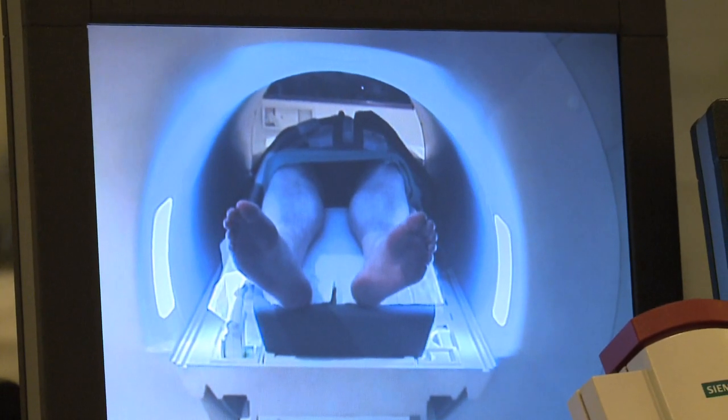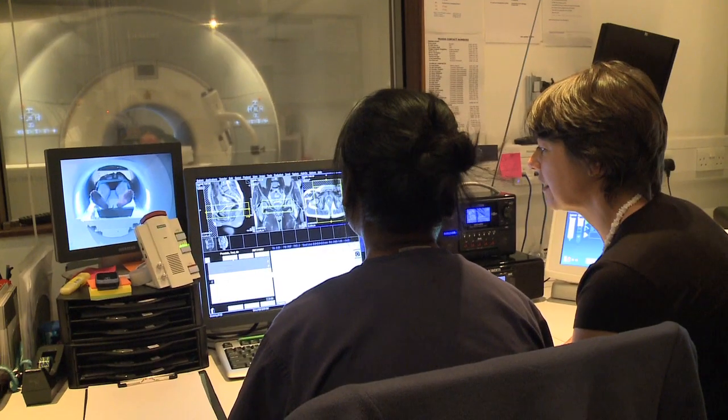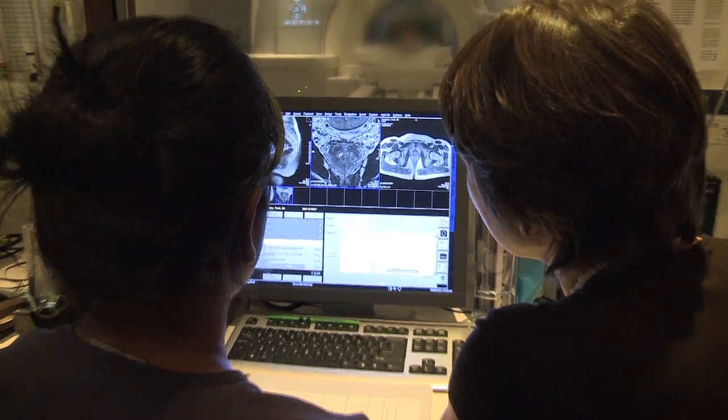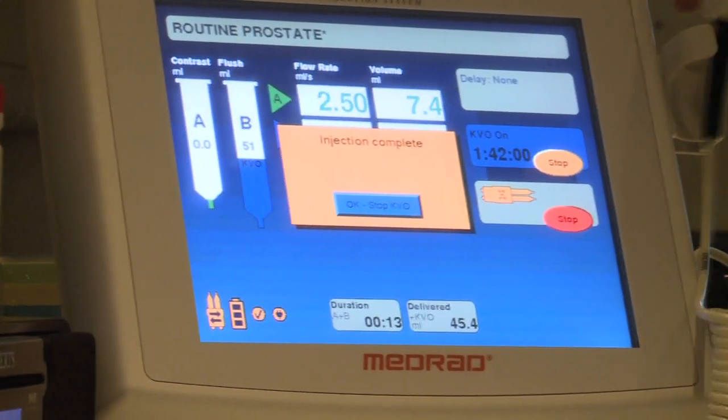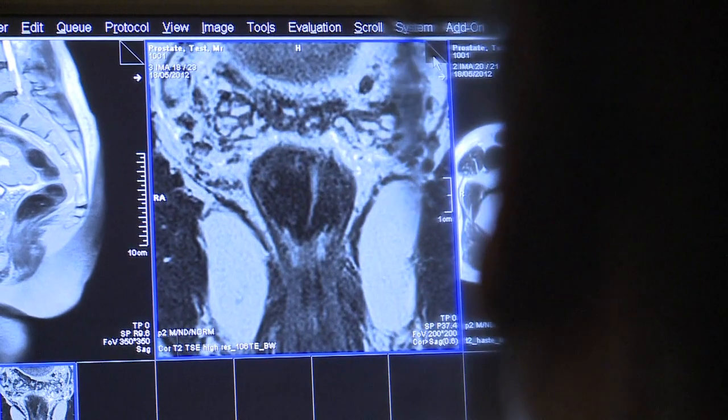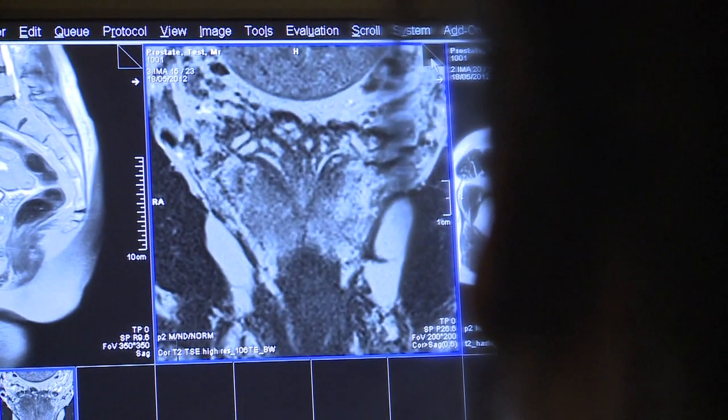We perform the MRI of the prostate. We do it multiparametric, so the patient gets a T2, they get a diffusion, and they get a gadolinium-enhanced scan. We do it prior to biopsy. It would be silly, I think, to stick 12 or 14 needles in a prostate with all the consequent bleeding and infection, and then image and think that you're going to see subtle lesions within. Therefore I think it is very important that we only do these very special diagnostics on prostates that are devoid of biopsy.